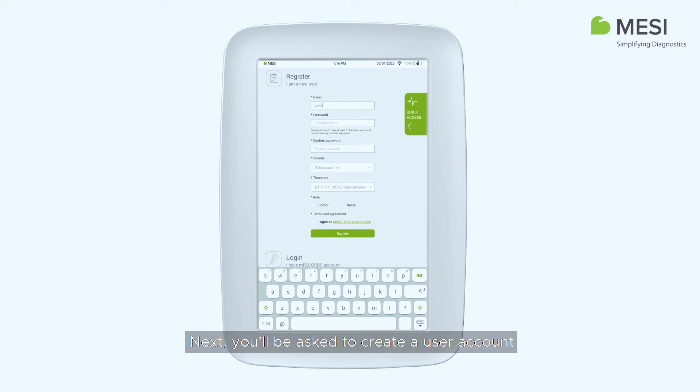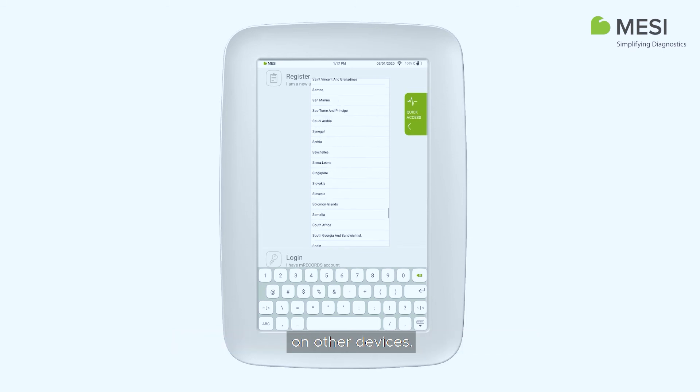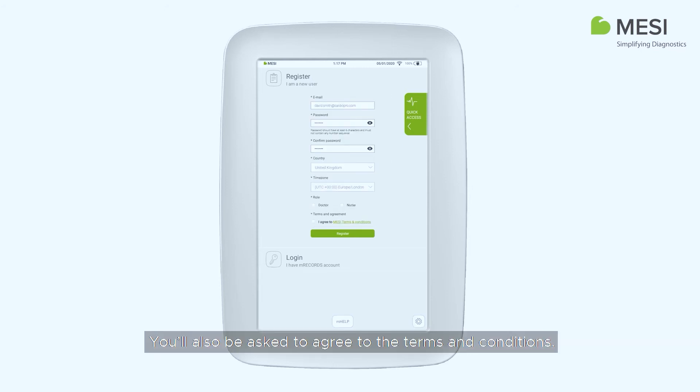Next, you will be asked to create a user account. Each user accessing the Macy M-Tablet should create a unique account, which will also enable them to access data securely on other devices. Enter your email address, password, country, and role. You will also be asked to agree to the terms and conditions.